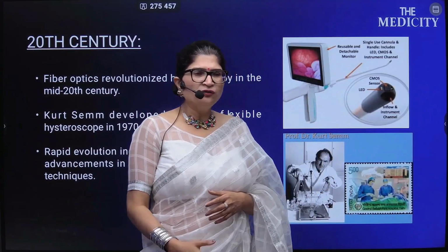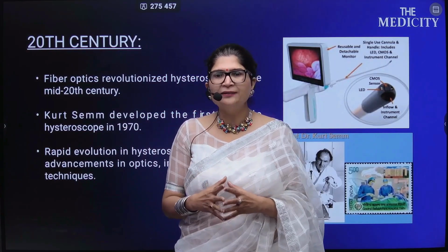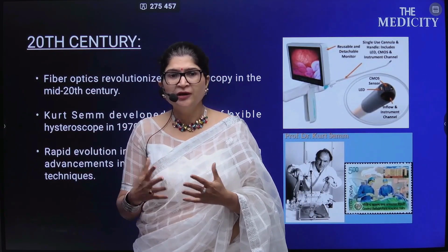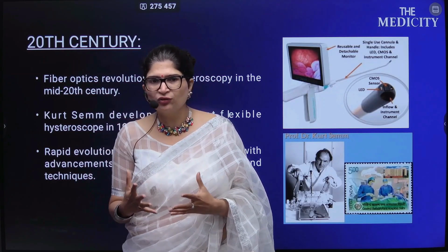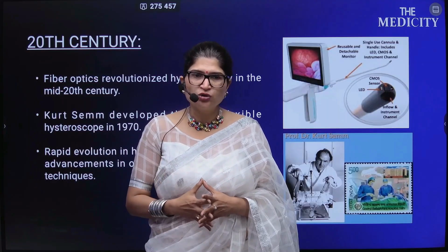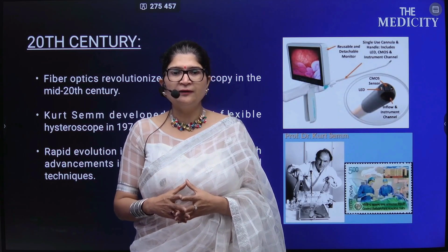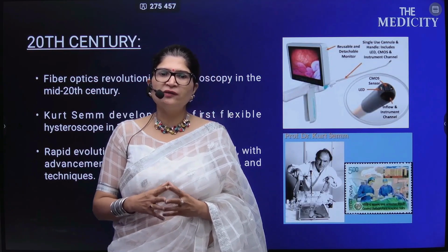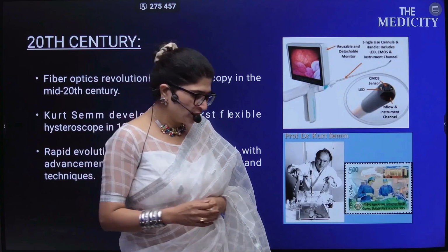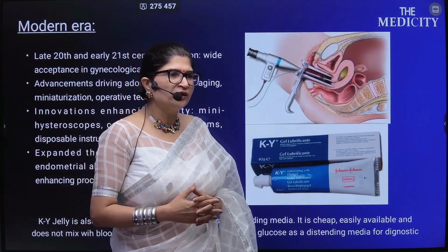With further advancements, the scope and the instruments got better day by day, and in the 20th century, fiber optics revolutionized hysteroscopy in the mid 20th century. The flexible hysteroscope was developed. There was a rapid evolution in hysteroscopy, followed by advancement in optics, instrumentation, and techniques, leading to further advancements in hysteroscopy.